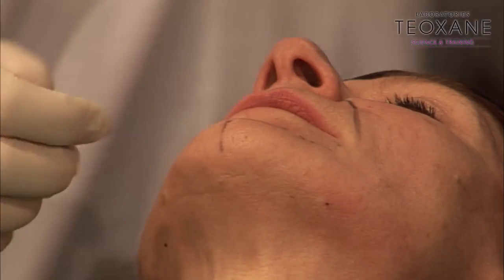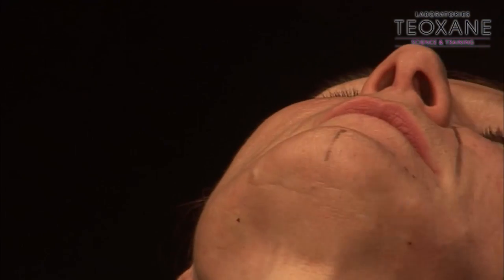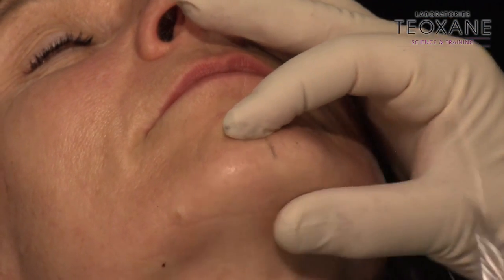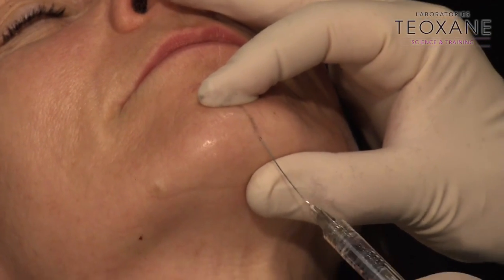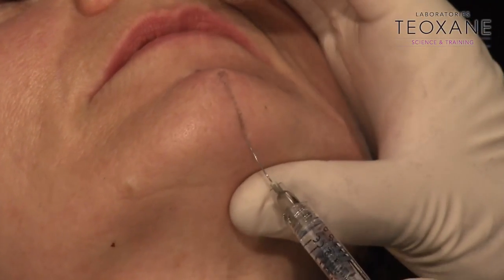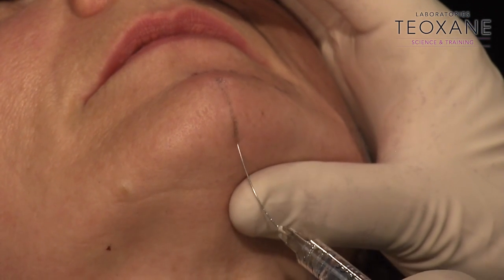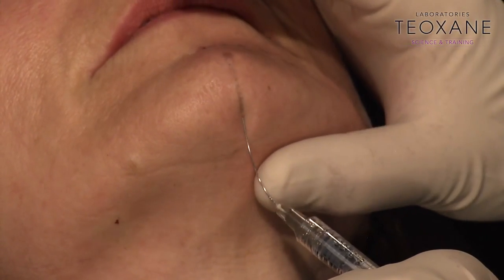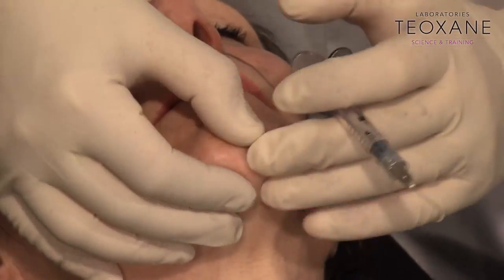And I can also push forward the chin. I have two ways to do it, or maybe I'm going to use a quite superficial way to do it today. Just a small needle hole to show you. Again, all this is invisible, of course. In and out, you see, voila. Again, you see, I'm going to push forward the chin, slight projection. She doesn't need too much. She needs a little readjustment because she has a very strong nose, very thin lips. So we need to readjust all that.